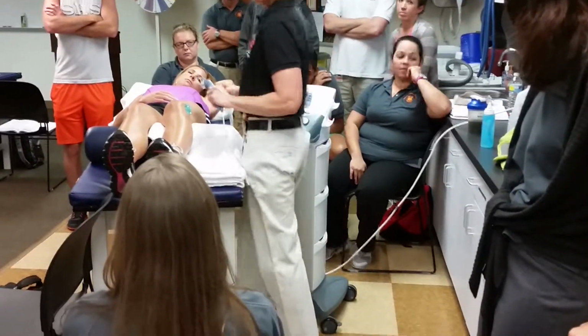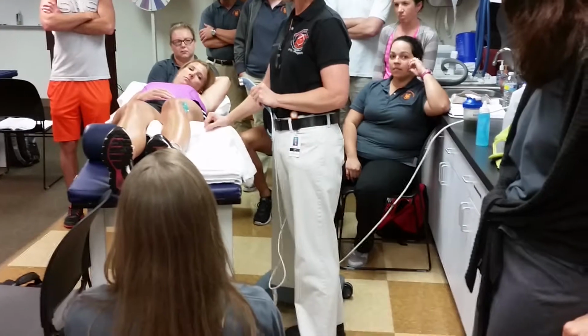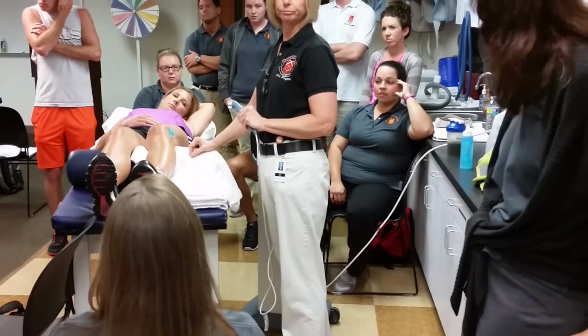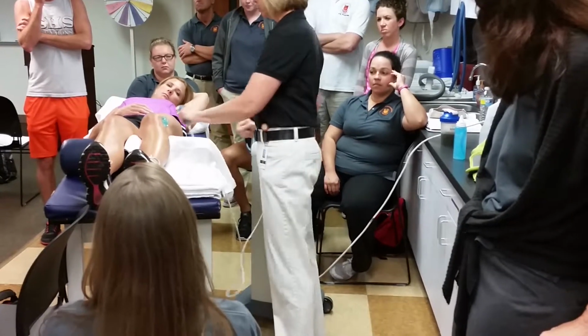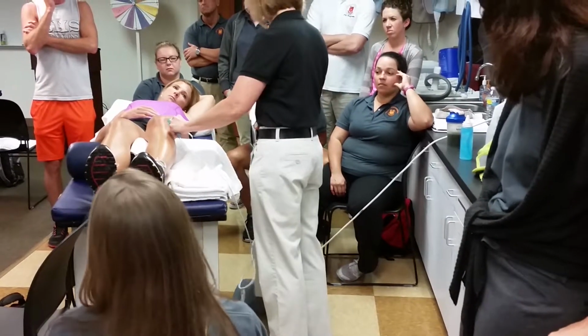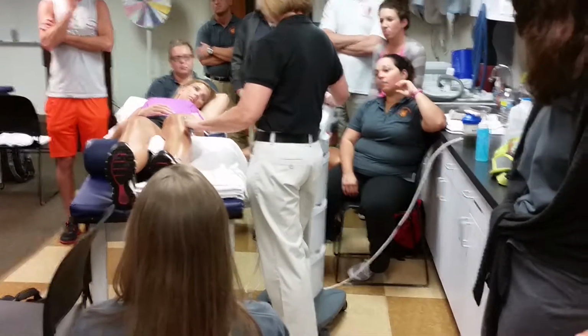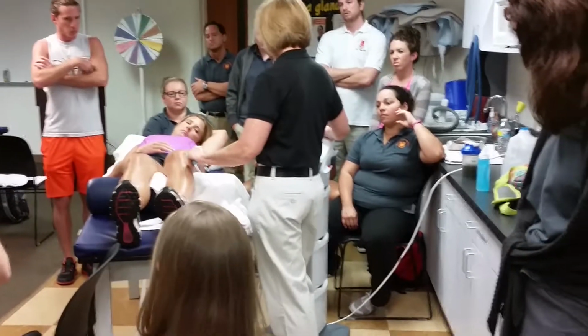How about contact? I heard that because of the crystals bouncing around, if you don't have contact, it can damage the unit. Yes. So before you turn it on and turn it up, you want to make sure that you have contact with the person, that there's gel there, because you could damage the crystal.